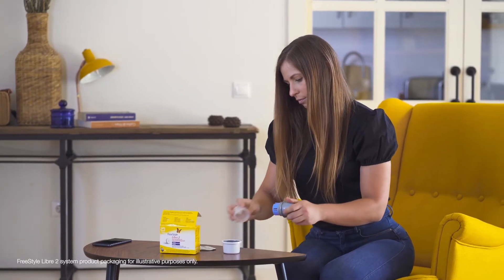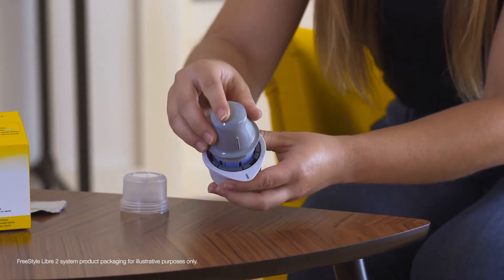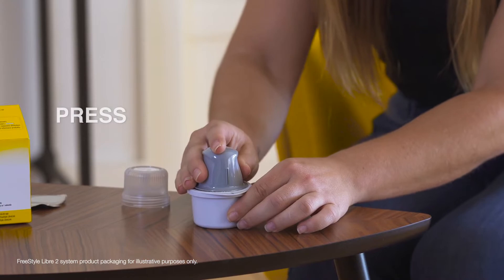Remove the lid from the sensor pack. Now take the applicator and unscrew the cap. Align the black line on the applicator with the black line on the sensor container, and press the two pieces together firmly on a hard surface until it comes to a stop. The sensor is now ready for application on the previously prepared site.